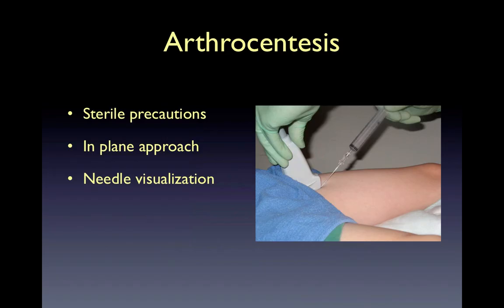Although not shown in this photo, a sterile probe cover should be used. Depending upon the age of the child, sedation may be necessary. The operator should remove as much fluid as possible, as this procedure is both diagnostic and therapeutic.